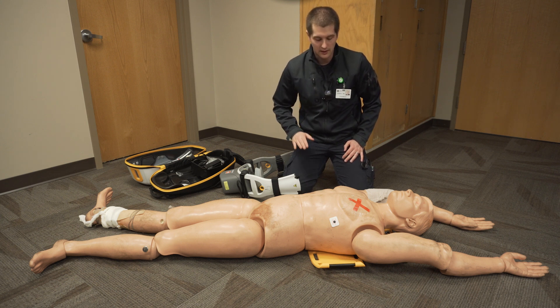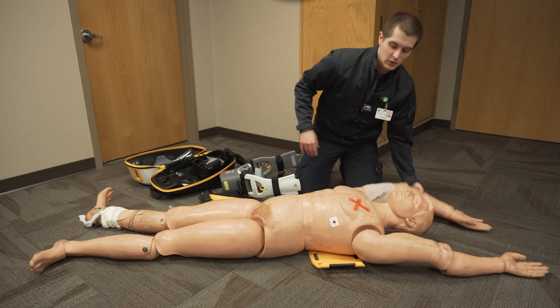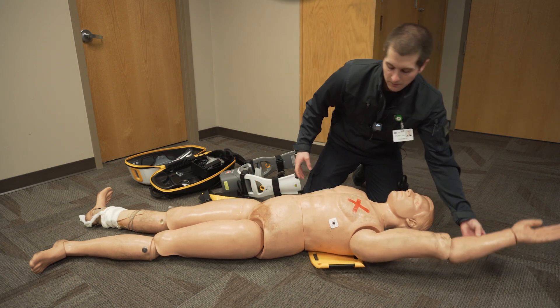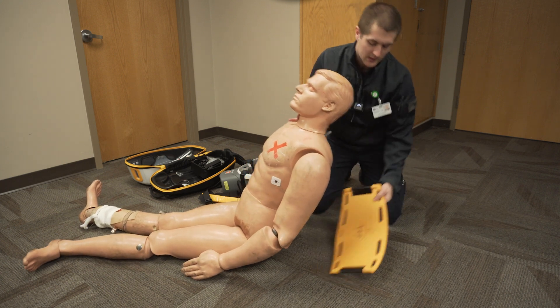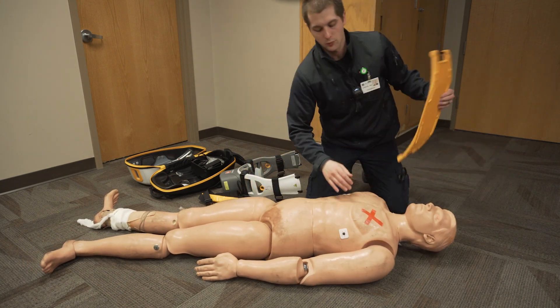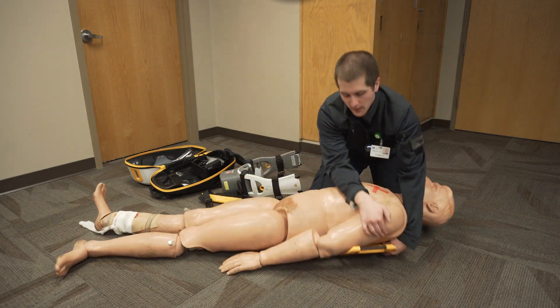One quick thing: if while applying the backboard under the patient it doesn't work to sit the patient up, the other option is a log roll — log roll the patient, set the board under them, and put it down.